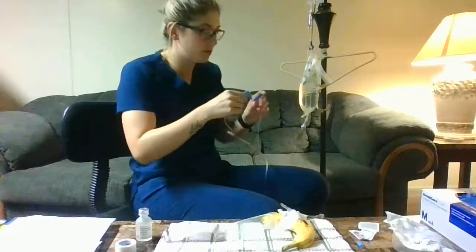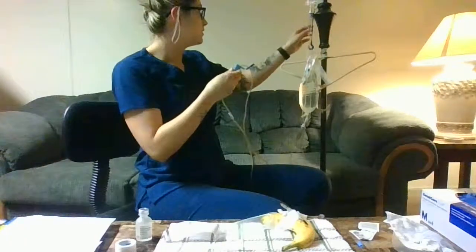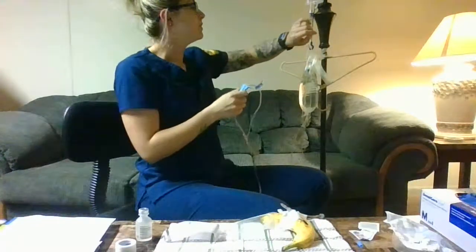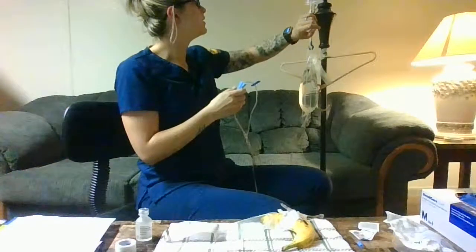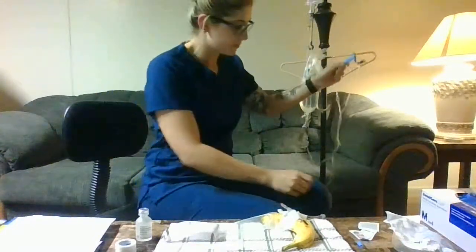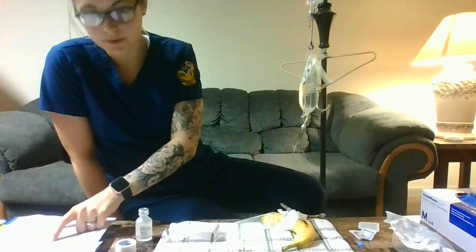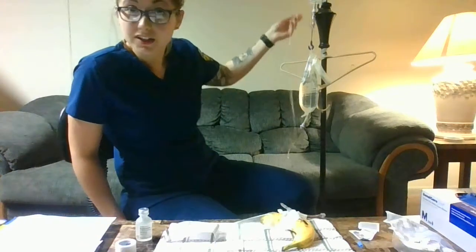So then you will watch here, and that's going pretty fast. So you're gonna look at your clock and make sure that you have 11 drops per minute. So you have that going, and it's to infuse over 45 minutes and to give 4 doses. When your infusion is complete, you are going to close your secondary tubing.